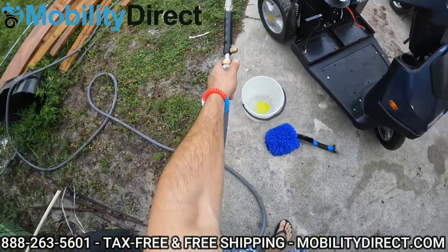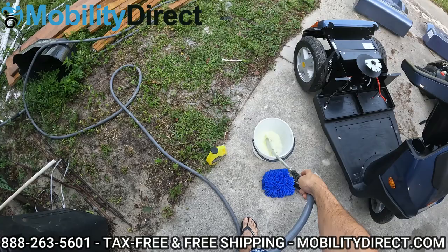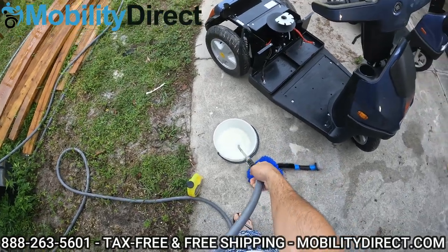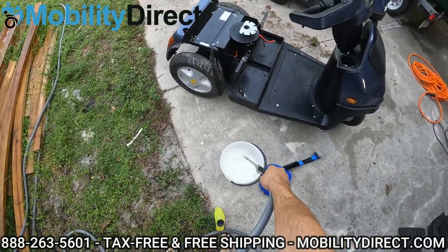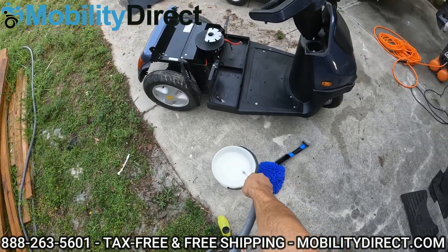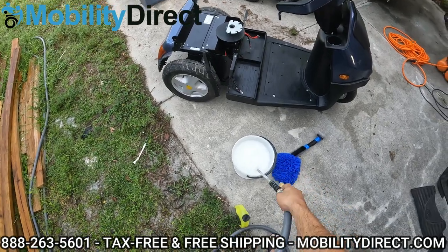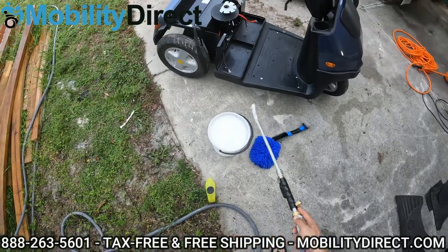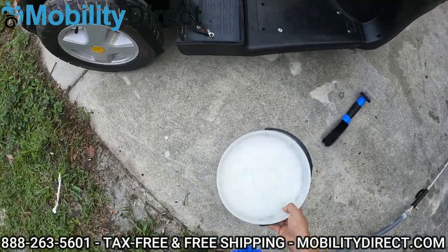We've got our hose attachment here. I recommend using a hose attachment with an on-and-off switch or lever like this one — it allows you to control the force and the pressure. I've got the lever barely open, and I'm going to fill up my bucket. These mobility scooters make awesome fishing vehicles, by the way. I love these mobility scooters — they are the ultimate off-road scooters, very stable, come with excellent warranties, very easy to repair, kind of like a big golf cart. So I highly recommend these scooters.